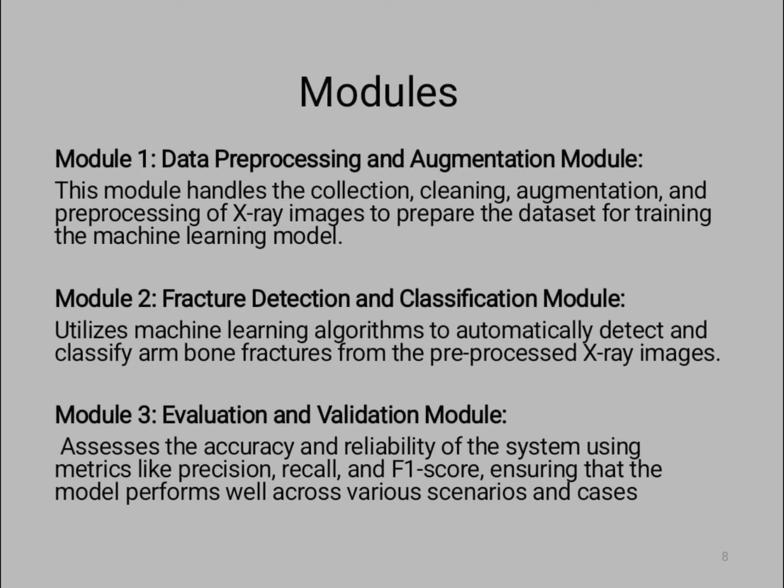Module 1 is the data pre-processing and augmentation. This module collects and prepares the X-ray images. It cleans, resizes and enhances them so the model can learn better during training.